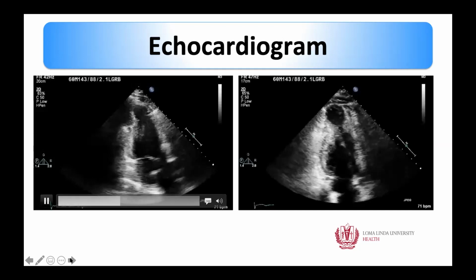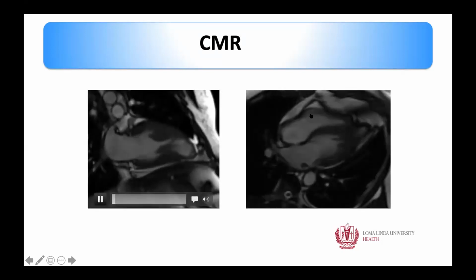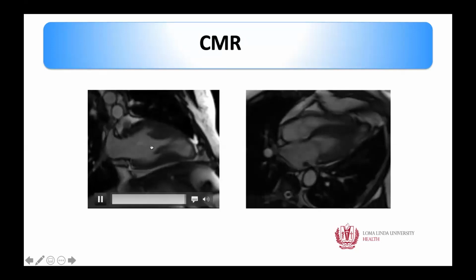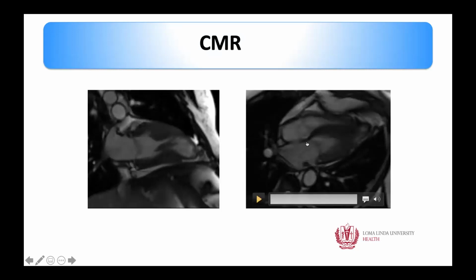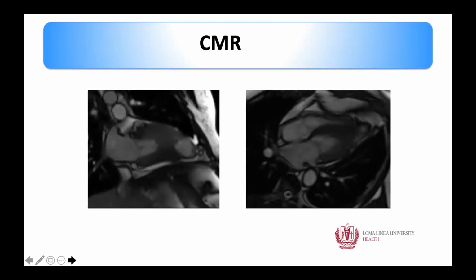And I just wanted to show this case. We sent the patient for MRI, and you can see the aneurysm again very well, as we saw it very well on the echo as well. You can see that the obstruction in this case is happening at the mid-ventricular level. So this is mid-cavity HCM associated with a very thinned-out and aneurysmal apex. You can see it both in the 4 as well as in the 2 chamber. So this patient, given his monomorphic VT, was sent for VT ablation.